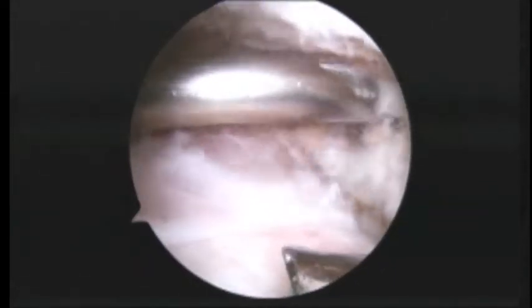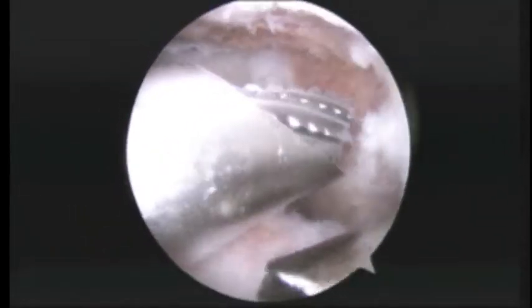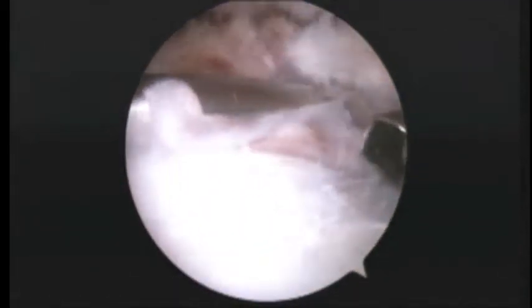Okay, so we're up above the rotator cuff in a part of the shoulder called the subacromial space. And what we're doing here is taking off a little bit of the anterior acromion. Let me get it positioned here so you can see. So this is a bone that makes up the roof of the shoulder. And you can see how this bone comes really close to the rotator cuff. There's the tear right there.